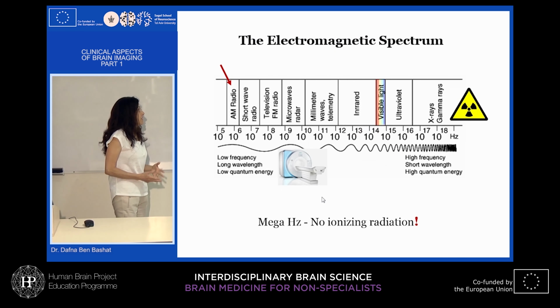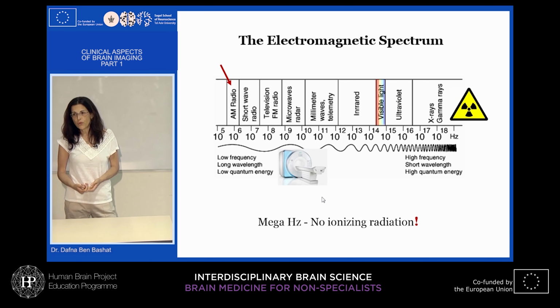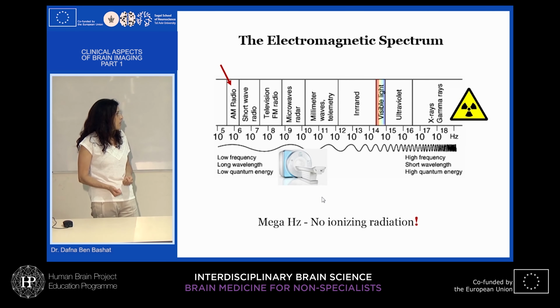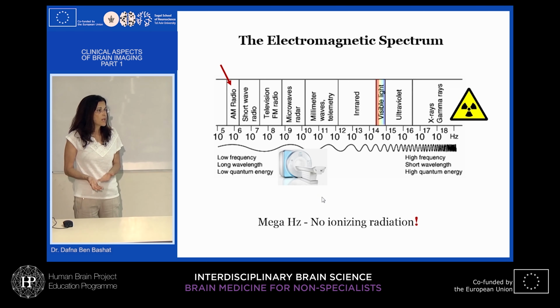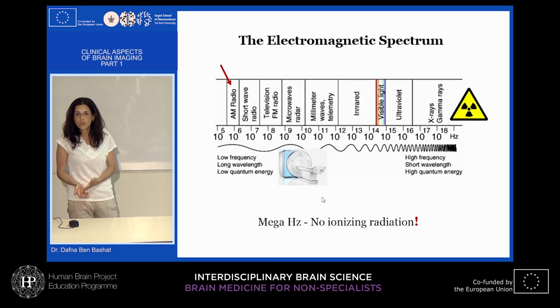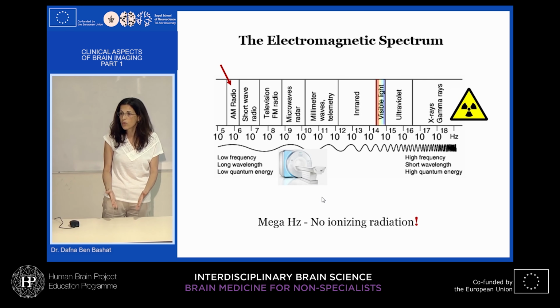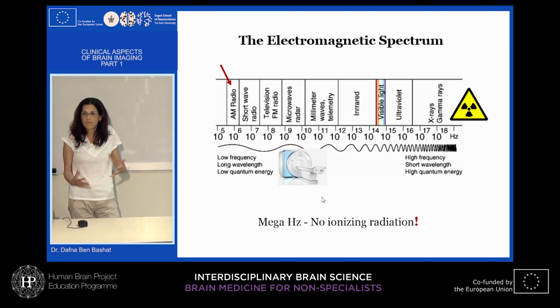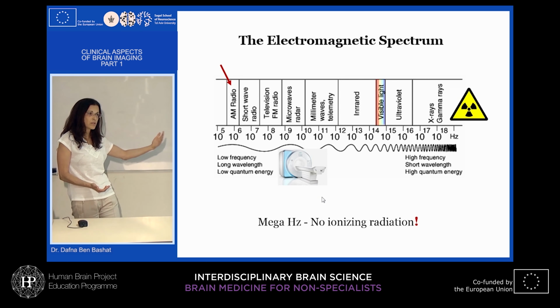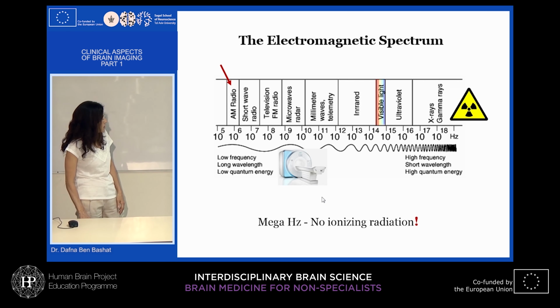Another advantage of MRI is that we transmit the energy in radio frequency, meaning it's non-ionizing radiation. So that's why we can have longitudinal scans on patients. There is no harm, no hazard for the patients. We can have a lot of volunteers, healthy subjects, and scan them longitudinally, for many hours. And this is important. PET has many advantages, but nobody will volunteer for a longitudinal study if he's healthy for PET, which is ionizing radiation.